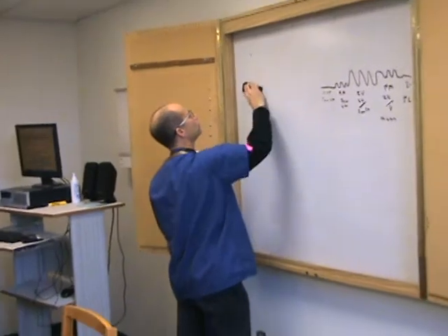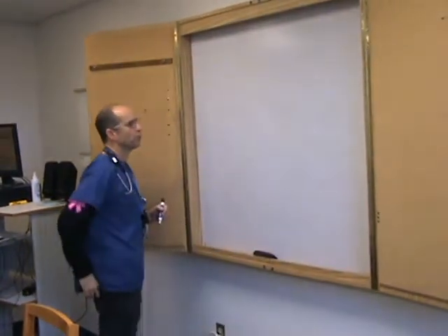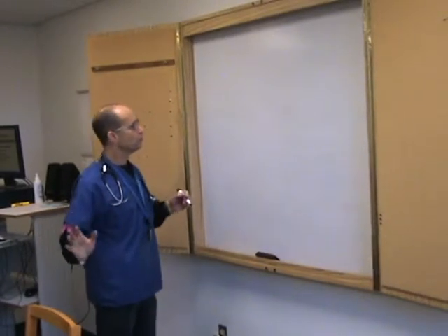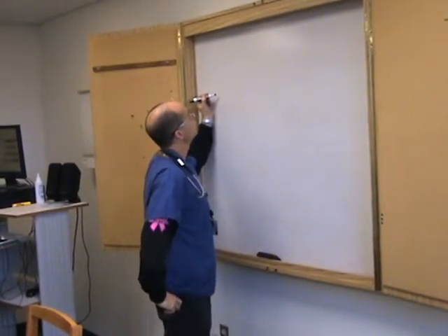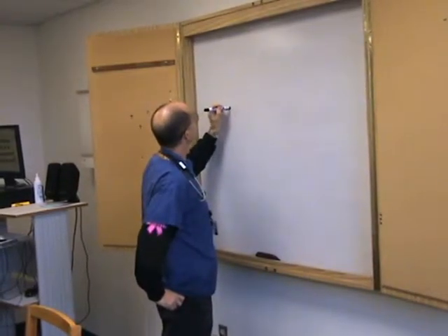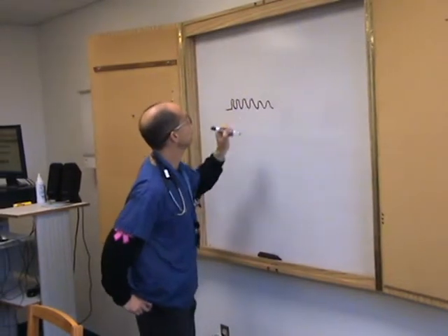So, flow tracks are a relatively non-invasive type of monitoring that hooks up to an A-line. And so what's the basis of the flow track? So the basis of the flow track, I guess, is this. So if you put an A-line into somebody, tracing will sort of look like this with a dicrotic notch and up and down, and you'll get your systolic and diastolic, and it should be pretty consistent.